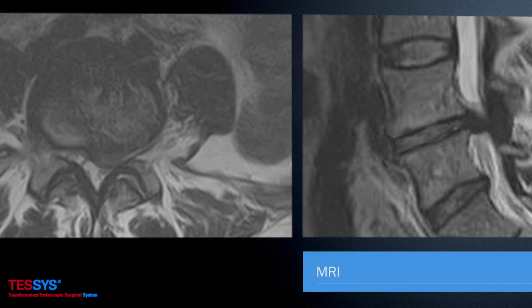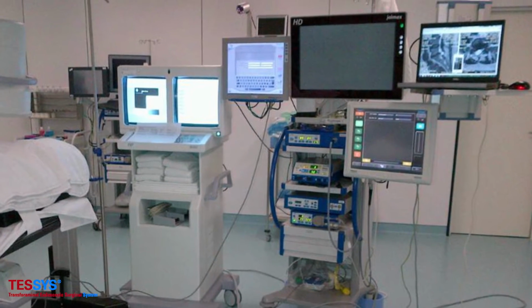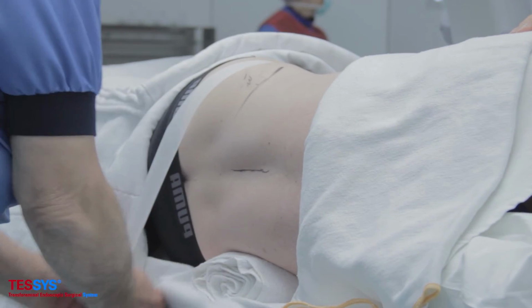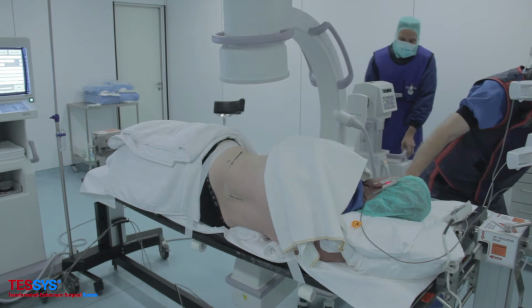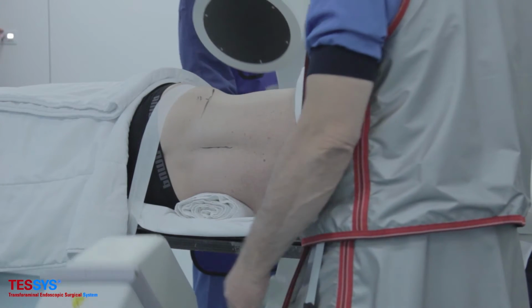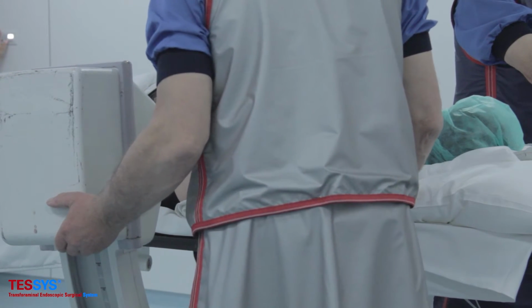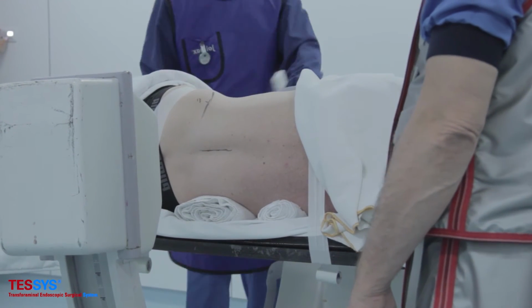The patient in this video is a 54-year-old man with a disc protrusion L4-L5 on the left side, having complaints for 10 weeks despite conservative treatment. The iliac crest and the middle of the spine are indicated. Orthogonal positioning of the patient on the operation table in two directions is extremely important. We fix the patient with ordinary tape on the operation table with a towel under the waist.